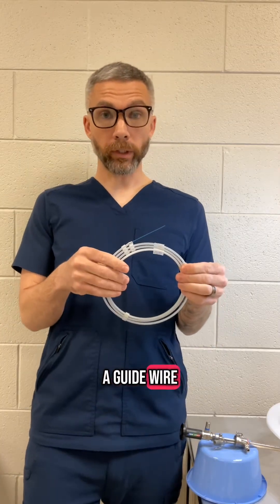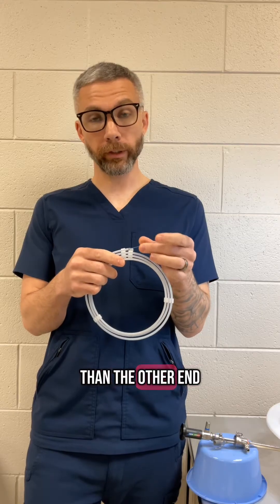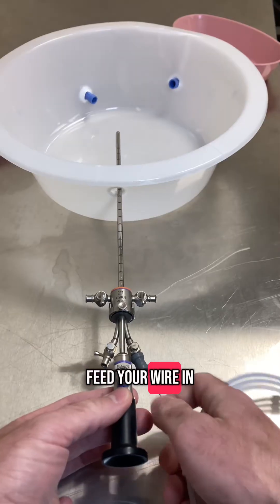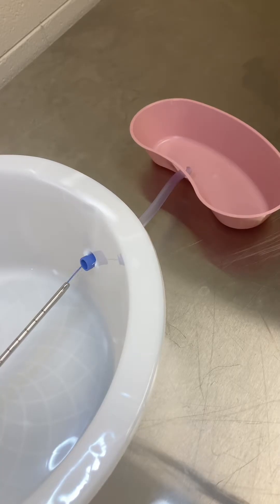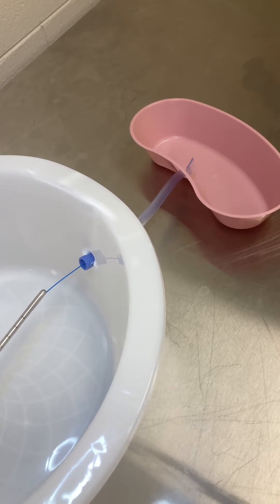You're going to have a guide wire. These guide wires have one end that's more flexible than the other end. You want to give them the more flexible, less rigid end — you don't want to give them the rigid end, risking poking a hole in the ureter. Feed your wire in and you'll see the wire come out of the cystoscope. Now I've fed it into the opening of the ureter.